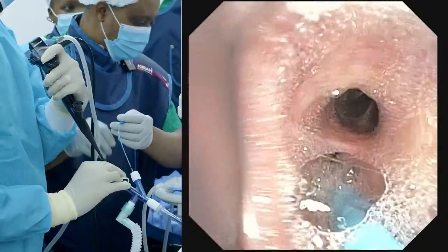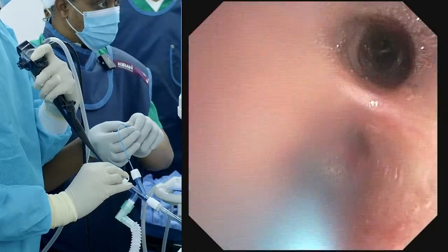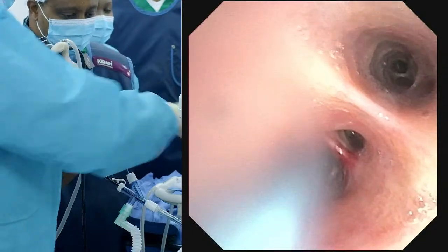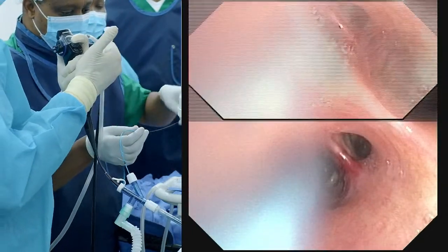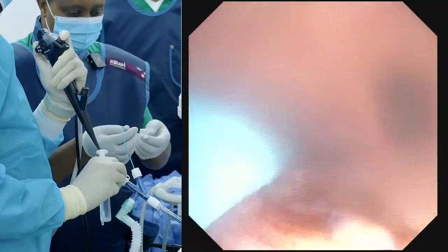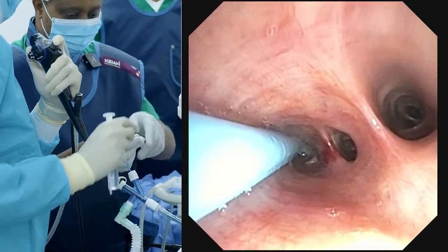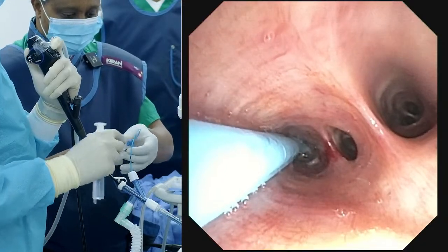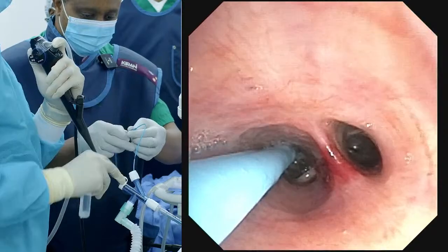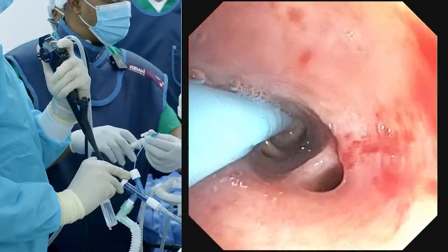Nothing with it is here. The guide wire can come out. We can test it in there. It's also because I'm a little better at placing them now. The right side is not across. It doesn't tend to be, just push it in. Yeah, we can inflate it. On the left. So we inflate under direct visual so that we can see the balloon. So I'm going to inflate.